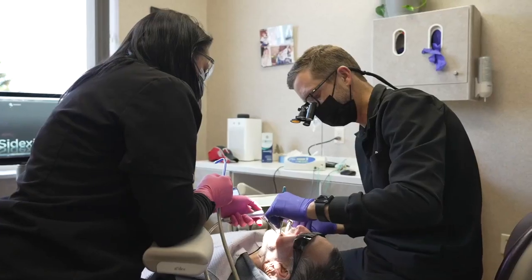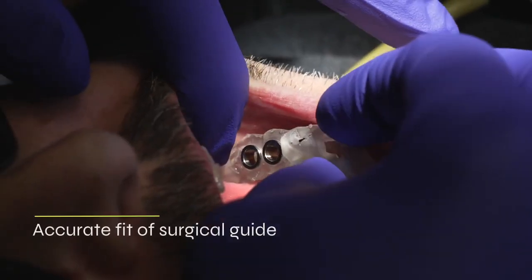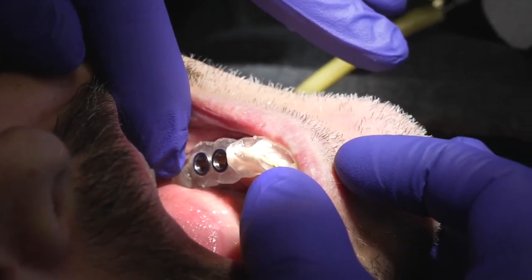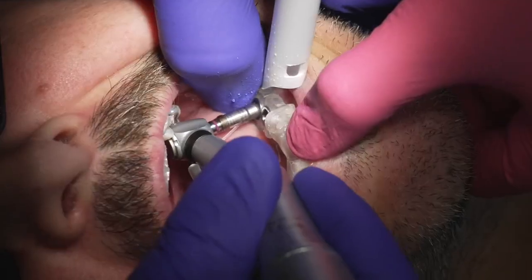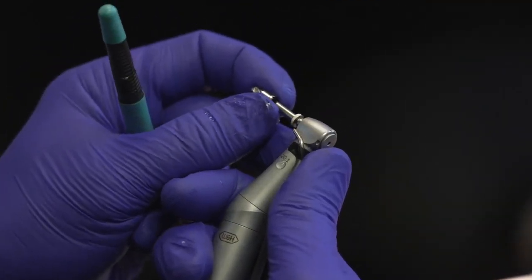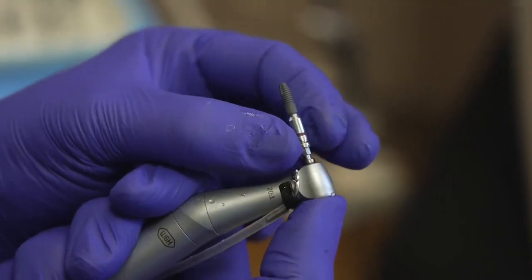Once the guide is sterilized, we're going to bring this to the mouth. The very first thing we're going to do is try this guide in, make sure everything is stable, make sure the fit is accurate, and get ready for the implant procedure. Once this is all done, we're going to go through the Astra Osseospeed EV workflow. We're going to do a tissue punch, go through the osteotomy sequence, and then get ready to place the Astra EV implants.